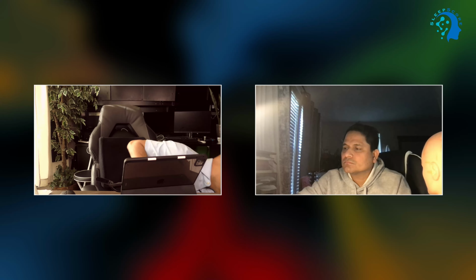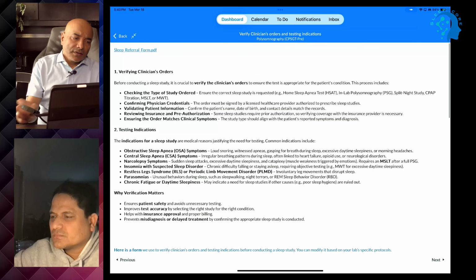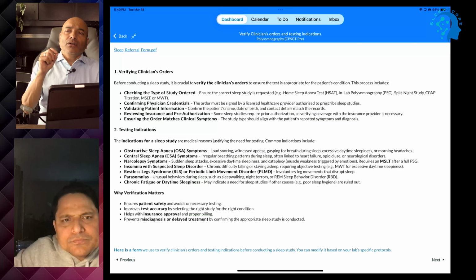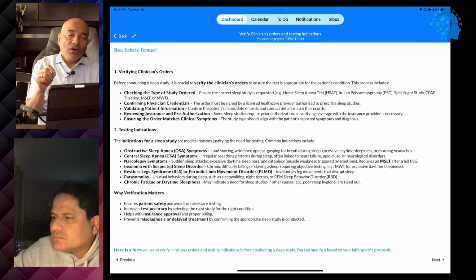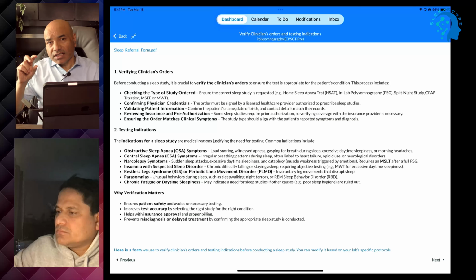Now let's go and check in our canvas again. Here, the first thing is to verify what kind of sleep study it is: home sleep study, standard in-lab sleep study, CPAP titration, split night test, or MWT.